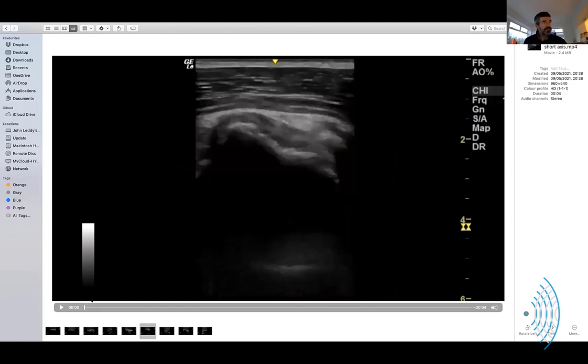Are you saying that normally it would appear a little bit larger than that? Or were you saying he has a normal sized one? It's not thickened. They are very variable in size. Okay. And that doesn't look thickened, but it does look tight, it does look short, it does look very well defined. Though everything on this gentleman anatomically was well defined.